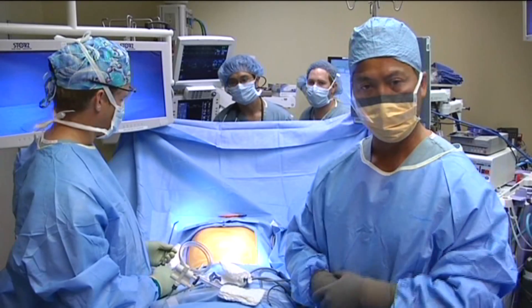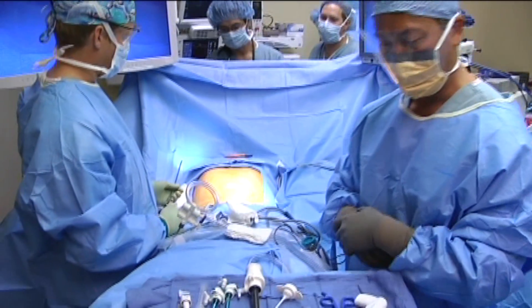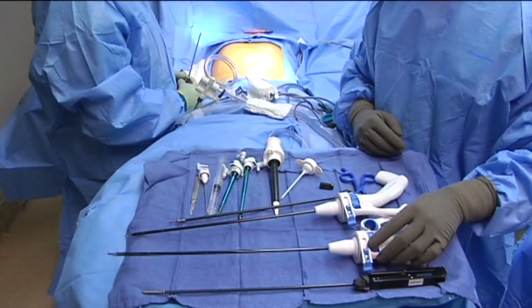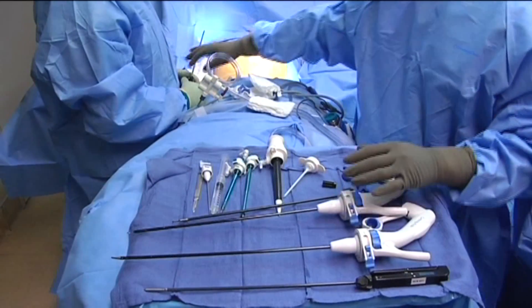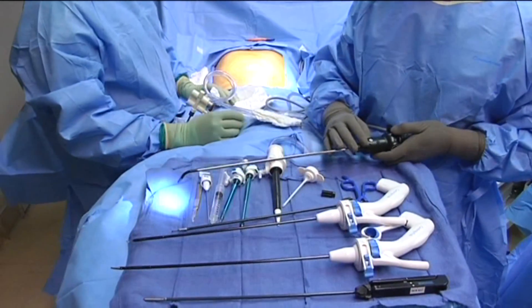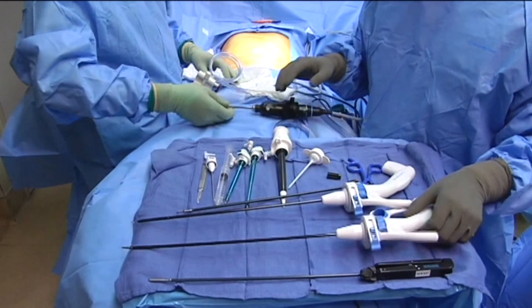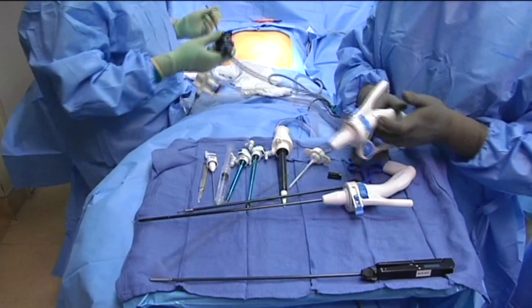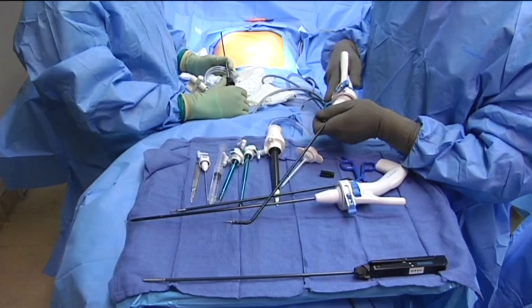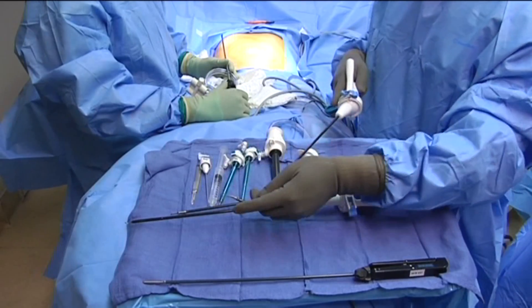We'll go over first the instrumentation that we'll be using for this operation. We're actually going to be using a combination of both rigid instruments and flexible tip instruments. In addition, the camera that we're going to be using is a flexible tip camera, which is shown here. These are the flexible tip instruments, and essentially when you pivot your end here, the tip will move.